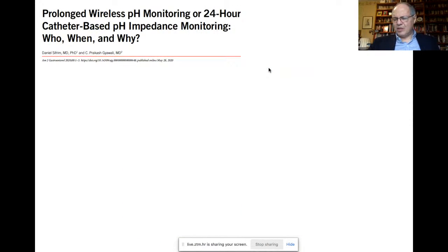There is a discussion about what to use, either wireless pH monitoring or impedance pH monitoring. And this discussion many times is biased by non-medical situations, either insurance coverage, economic convenience in some centers, and so forth.